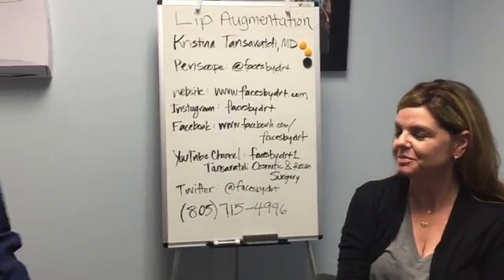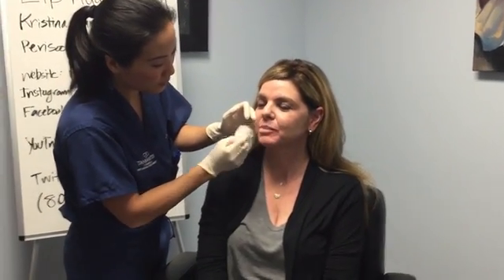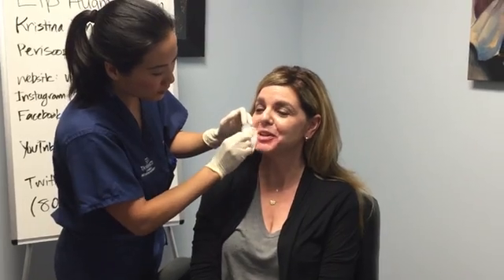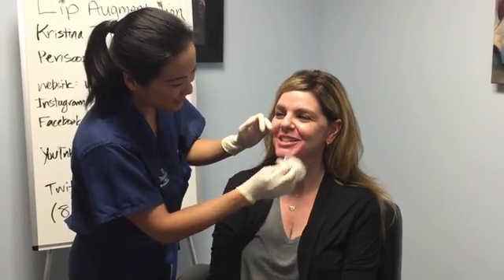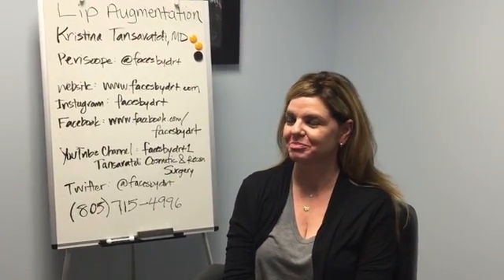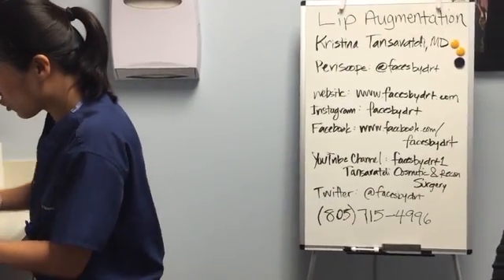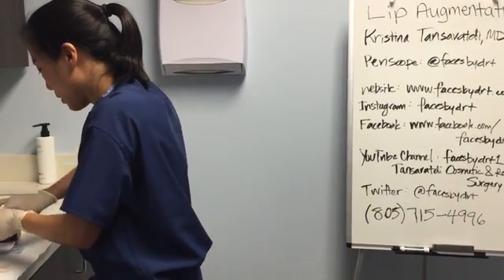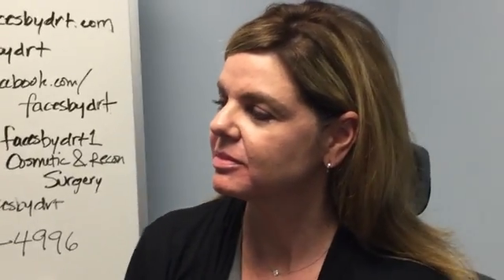Got some alcohol. So we're going to wipe away that numbing cream. Does it feel pretty numb at this point? It's very numb. It's been sitting there for a while, right, Lori? Yes, I think I'm good. Okay, we didn't get any on your tongue? No. Okay. Now there are many ways to block the lips. Usually the numbing cream is sufficient, but for some people I will do a lip block just to create more pain coverage, but most people don't need it.